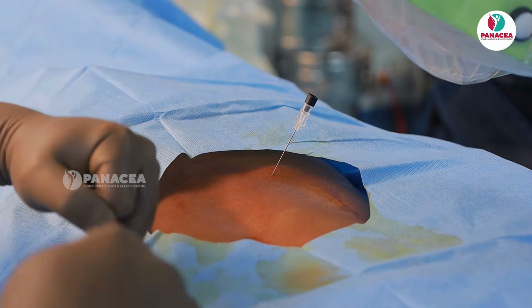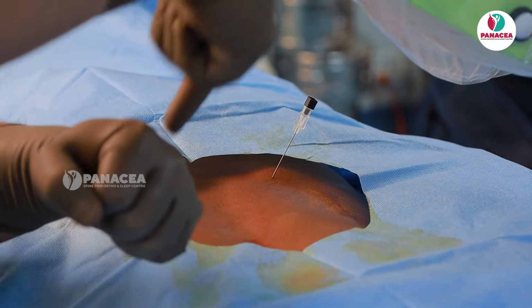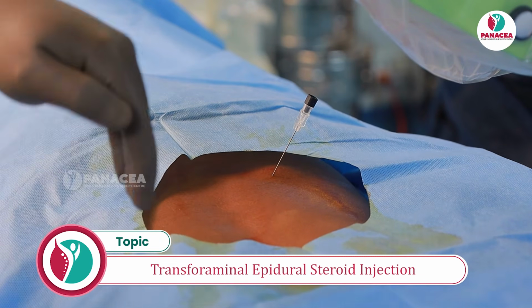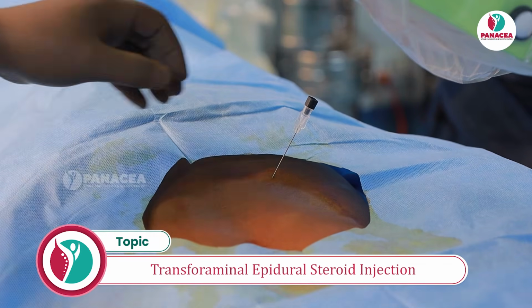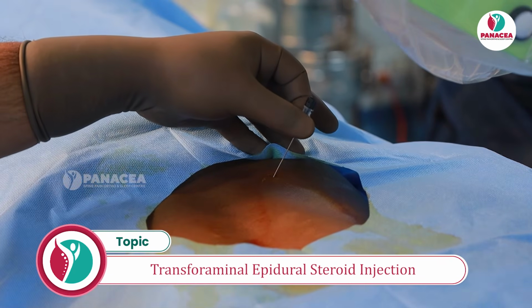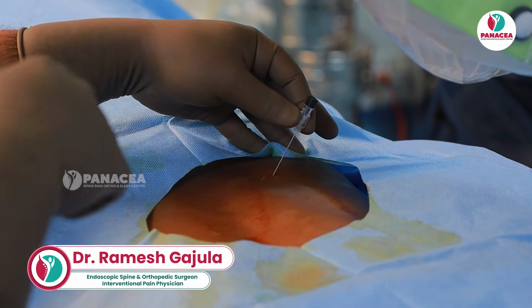Now let us imagine the SAP is like this. My needle is hitting like this, so I have to slip it. So now I will use the bent tip in order to steer to the lateral border and then go underneath the SAP. Now you see my slot is towards the lateral side, so the needle will try to move medially. So I am making the slot towards the medial side so that the tip will go laterally.